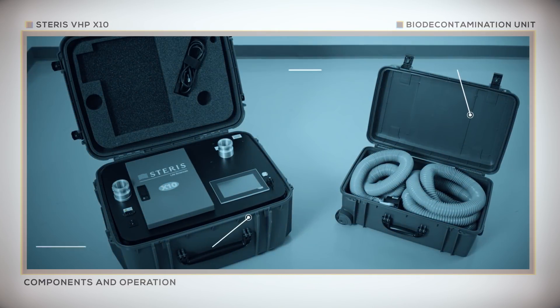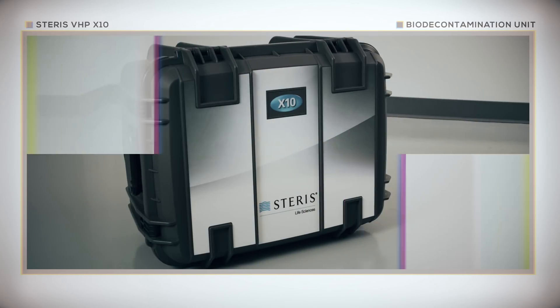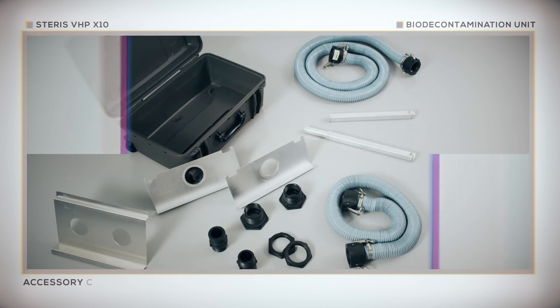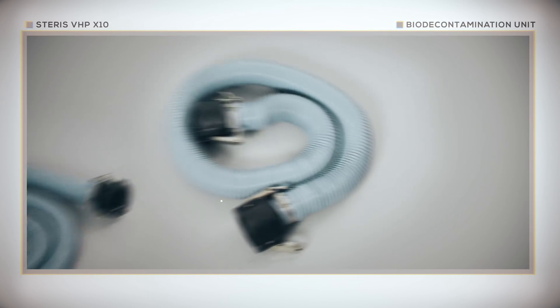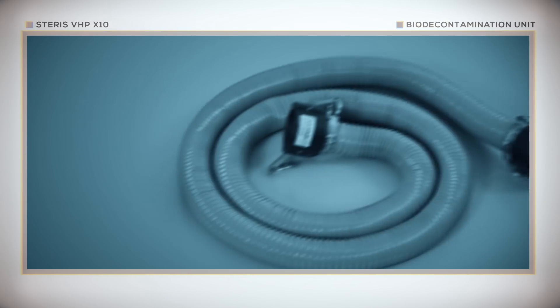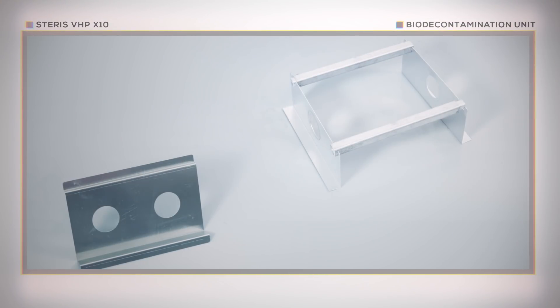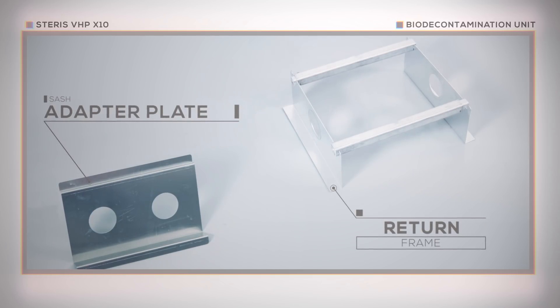Let's look inside both the VHP X10 Bio-Decontamination Unit and Accessory Kit. Both are housed in rugged, secure, and highly transportable cases. The accessory case contains the necessary hardware to connect the X10 unit to a biological safety cabinet. The case includes two hoses: a 5-foot hose that connects to the outlet port of the X10 unit, and a 10-foot hose that connects to the return inlet of the X10 unit. The sash adapter plate and return frame make connection to the biological safety cabinet for decontamination easy.